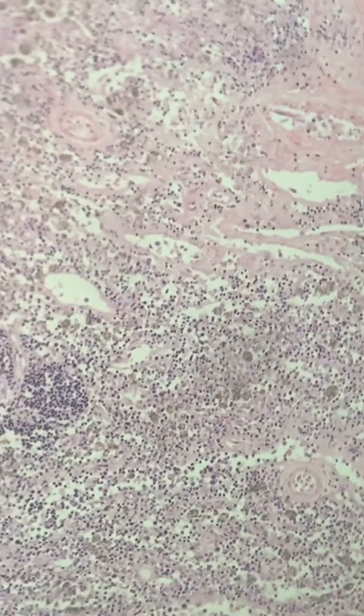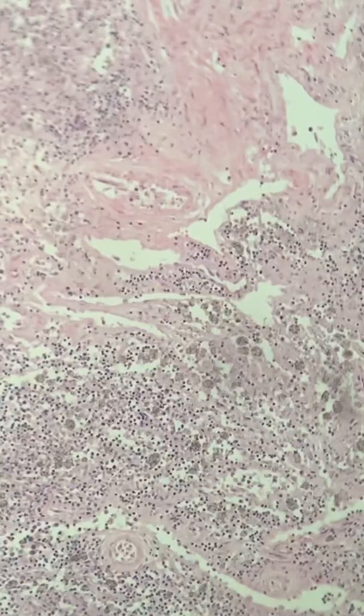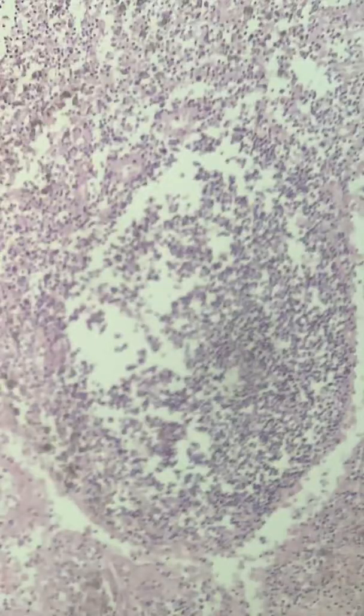And as we go closer, I'm going to show you some actually necrosis of some of the lymphocytes. If I can go further. When I get to an area, I'll go down and show you some necrosis of the lymphocytes. And that goes with some lymph nodes, with viral lymphadenitis, you're going to see some necrosis of the lymphocytes. Okay, but let me see if I can get to an area before I waste your time.